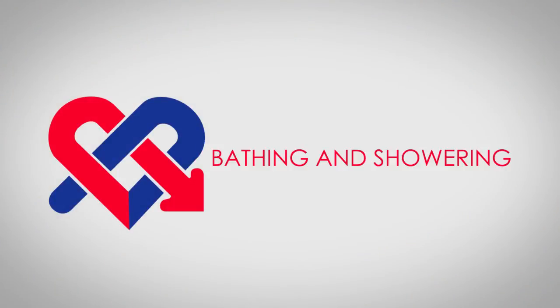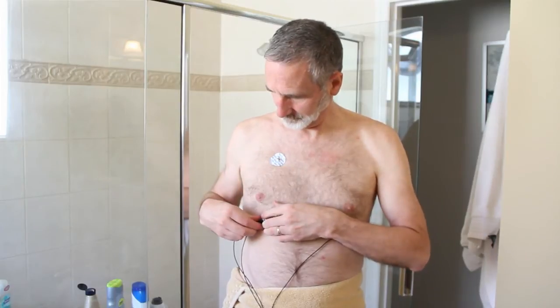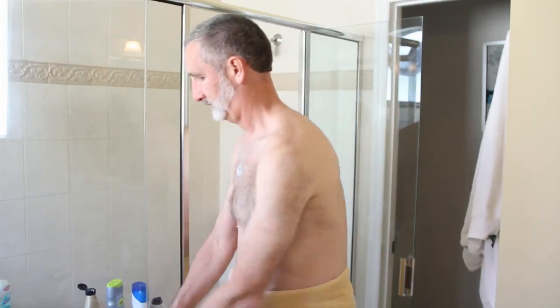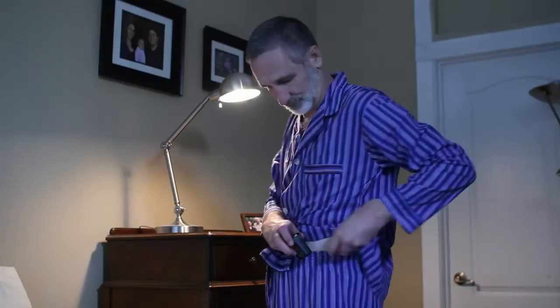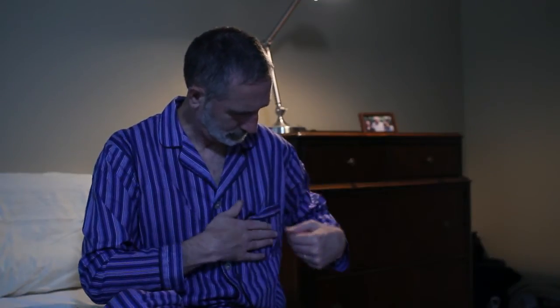Bathing and showering: before you shower or bathe, unsnap the wires from the electrode patches. You may leave the patches on your chest, but avoid applying water and soap directly to them, unless you are changing your patches — in which case, getting them wet may make them easier to remove. Sleeping suggestions: wear the pendant on the waistband of your night clothing, place the pendant beside you with the wires extended as much as possible so that you don't roll over the unit, or wear a shirt with a breast pocket and place the pendant in the pocket.